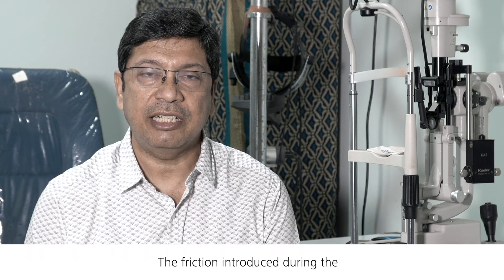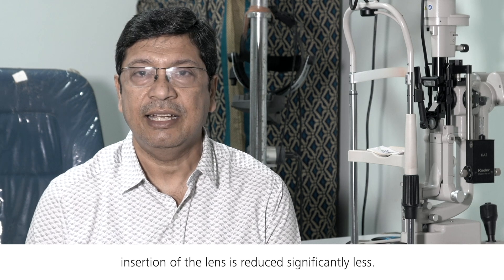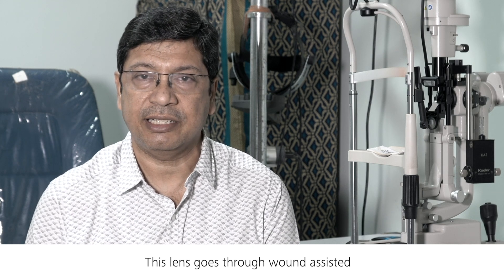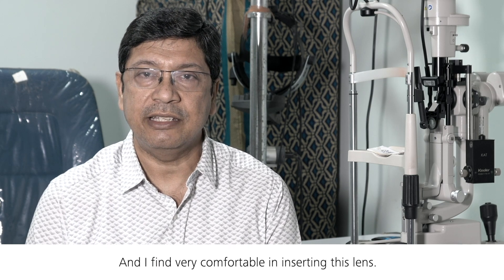The friction introduced during the insertion of the lens is reduced significantly. I normally practice a 2.2 millimeter incision, and this lens goes through a wound-assisted technique of insertion, and I find it very comfortable inserting this lens.